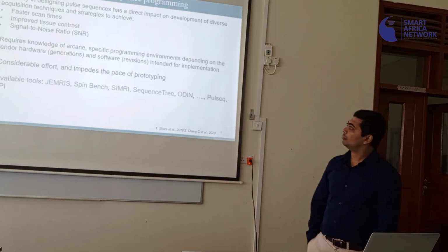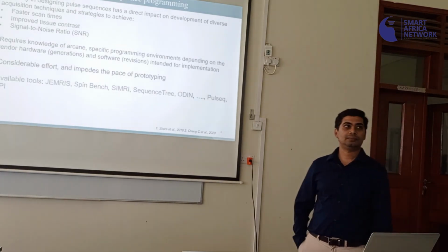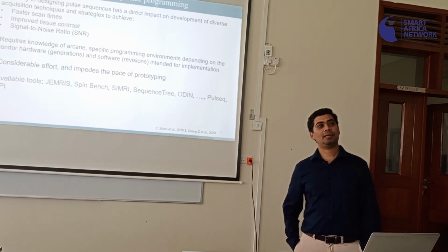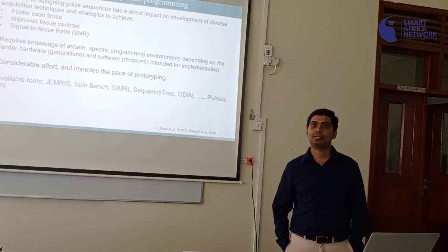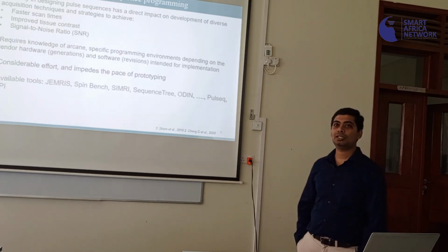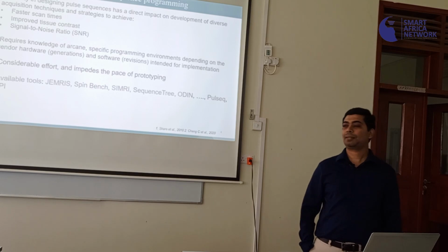For that, I've listed about 3 specific uses. At low field specifically, you can't be scanning somebody for 40-45 minutes. So if you know these tools of what I'm going to show, you can probably scan faster. You can improve signal to noise ratio if you did some of the tricks using pulse sequence programming.